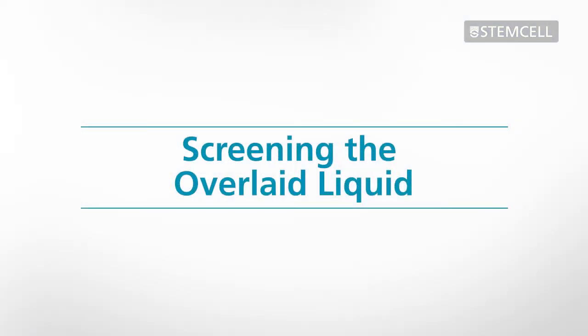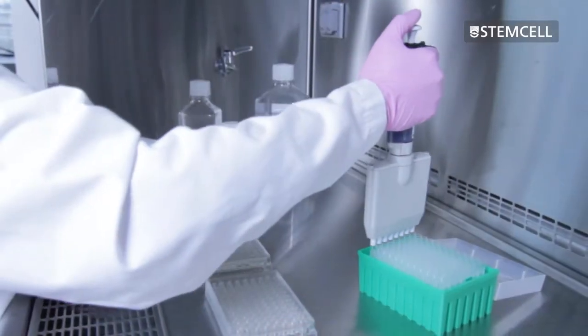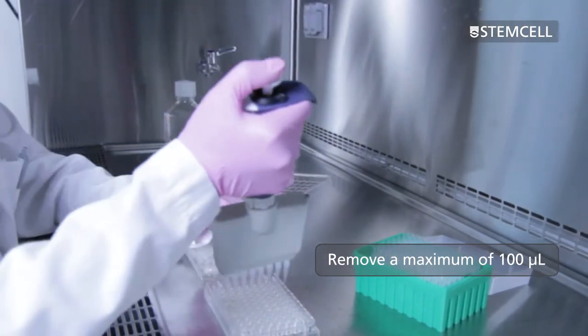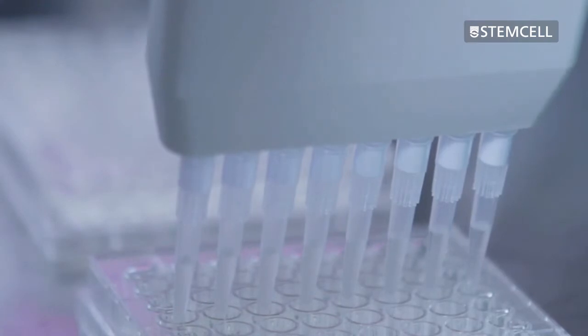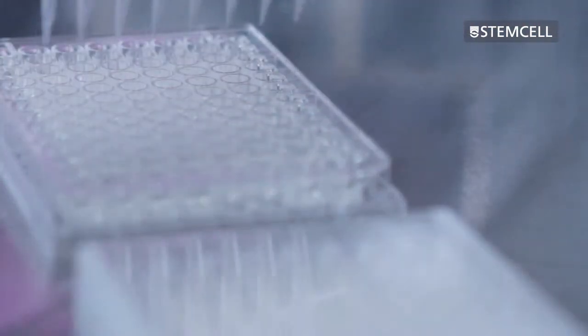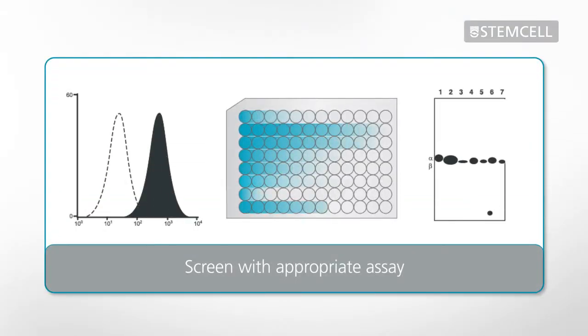The next step is to screen the overlaid liquid medium for the protein product of interest to identify producing clones. Carefully remove a maximum of 100 microliters of the overlaid liquid medium from each well. Leave the remaining liquid, about 50 microliters, on top of the semi-solid culture to ensure that the colonies are not disturbed. Test the supernatants for specific protein products using an appropriate assay.